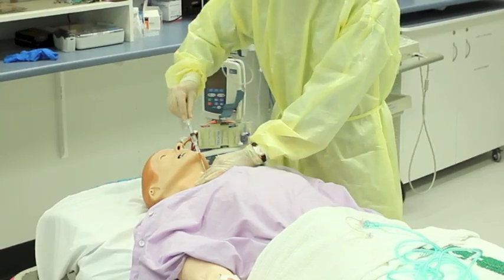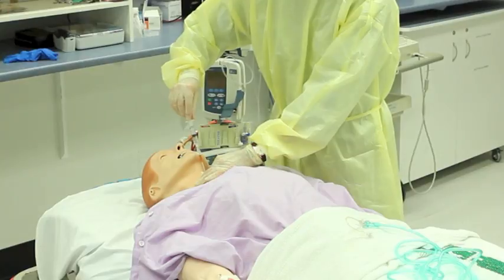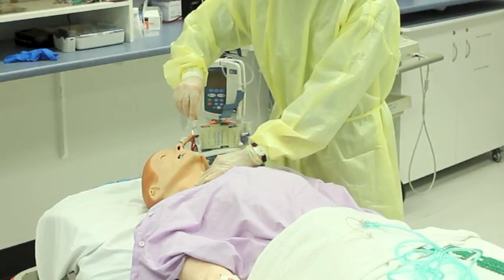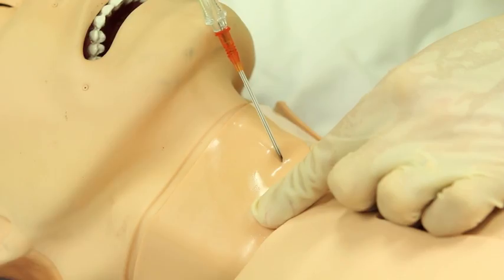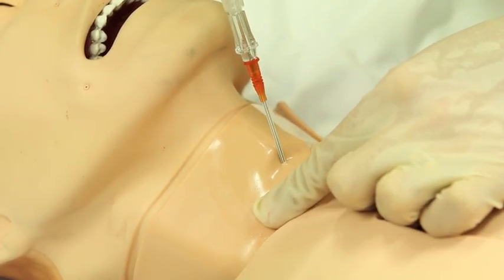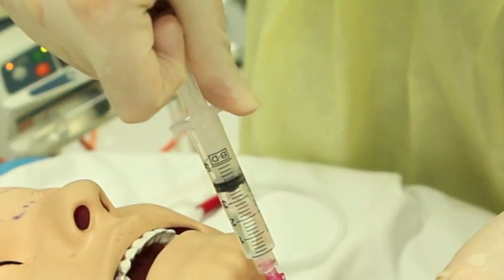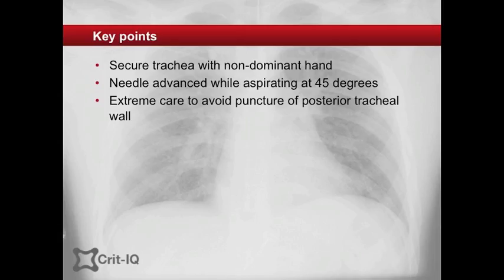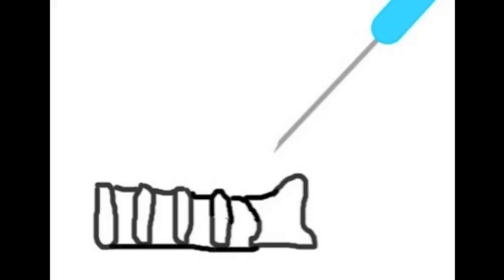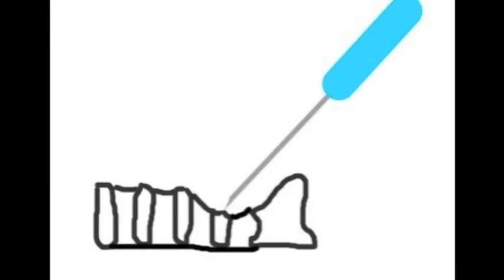While securing the trachea with the non-dominant hand, the needle is introduced in a caudal direction at a 45 degree angle to the skin. The needle is carefully and slowly advanced, while the syringe is aspirated continuously as the needle is introduced, until air can be seen bubbling through the saline. Great care must be taken to avoid inadvertent puncture of the posterior wall of the trachea. This is particularly so in young children, as the cartilages of the trachea are very soft, and the trachea can be completely compressed by the needle if not careful.